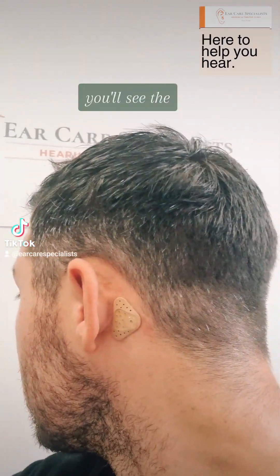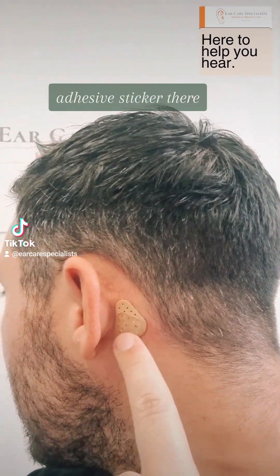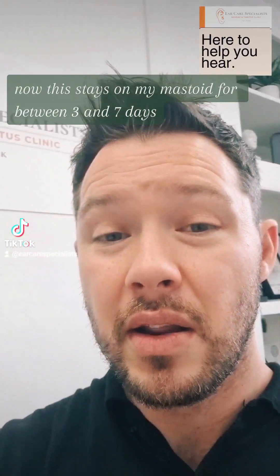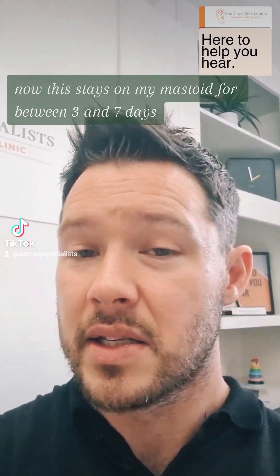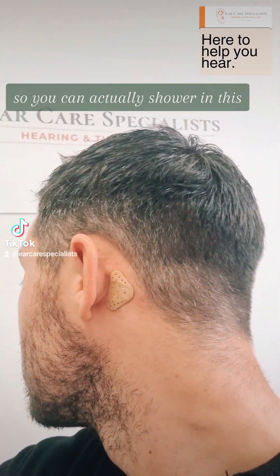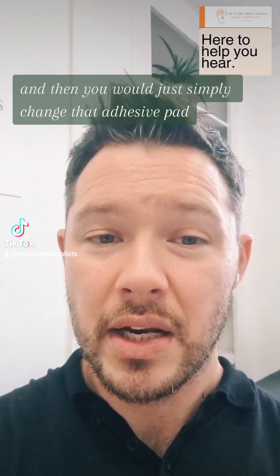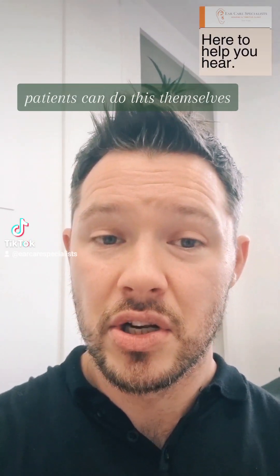If I just go back, you'll see the adhesive sticker there. This stays on my mastoid for between three and seven days, so you can actually shower in it and it can stay on there quite nicely, and then you would simply change that adhesive pad. Patients can do this themselves.